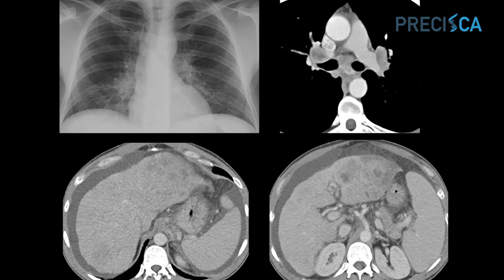Now, occasionally, you'll see bland embolism that is on top of the tumor embolism, and that's probably some in situ thrombus that's formed. So it's not uncommon to have a part of the embolic phenomenon that doesn't enhance and a part that does enhance. So we always look for areas that enhance, even if only a portion is enhancing, and we get concerned that we're dealing with embolic tumor to the pulmonary arteries. And in this case, again, this was hepatocellular carcinoma.